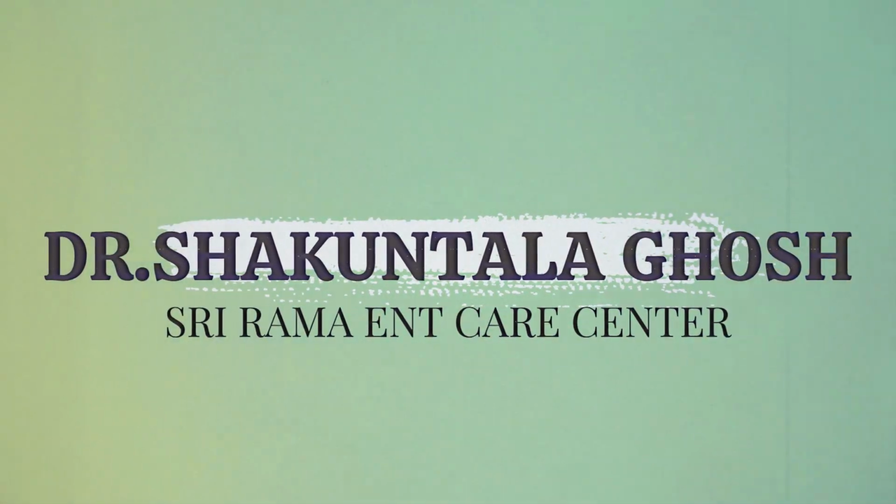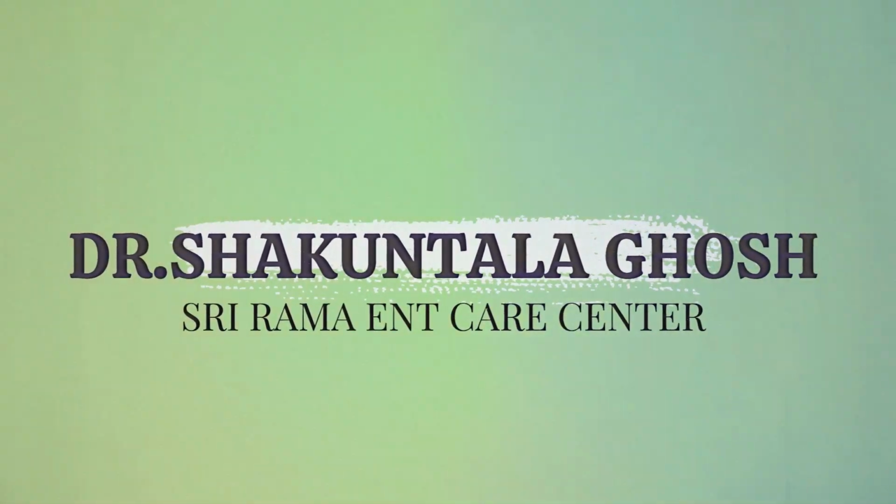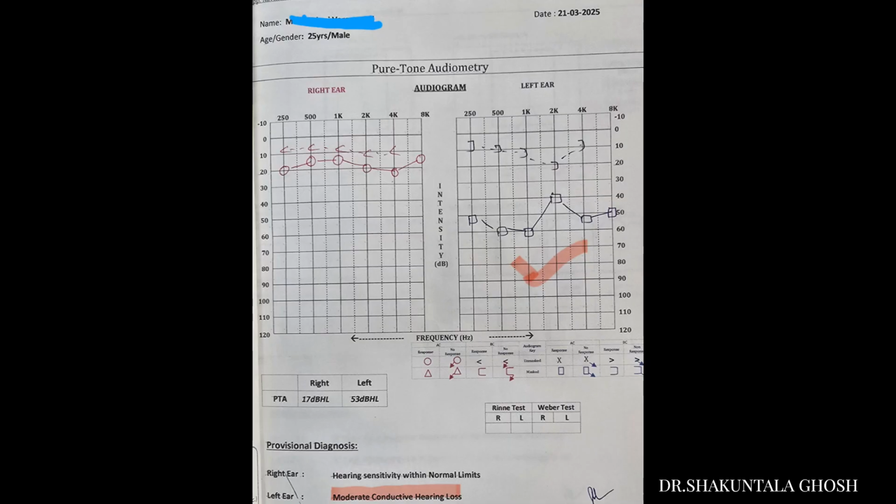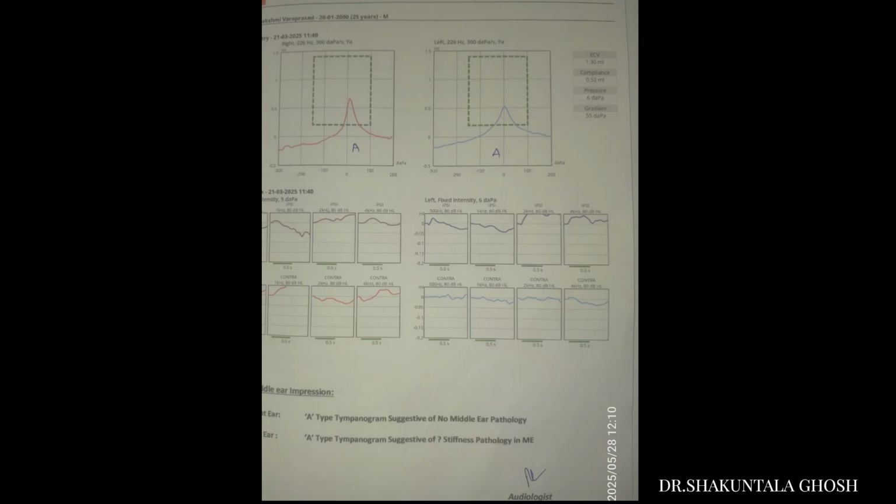Hello everybody, today I am going to talk to you about a case of unilateral otosclerosis in the left ear in a young adult where I did left side endoscopic stapedotomy. This is the PTA report showing 53 decibel conductive hearing loss in the left ear with Carhart's notch at 2K, and the impedance shows A type in both the sides.